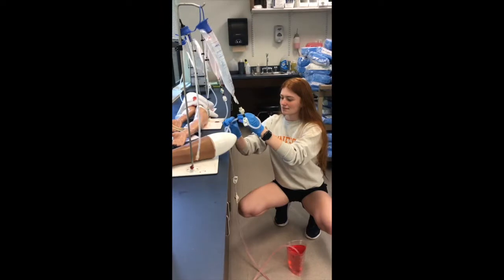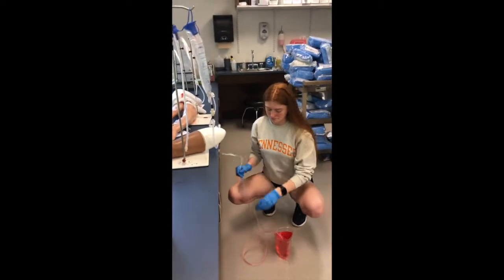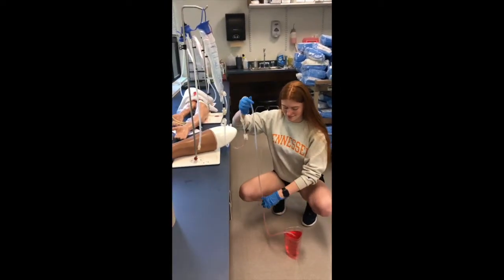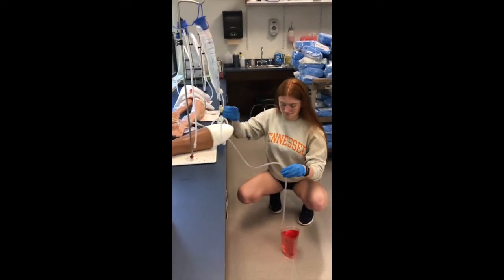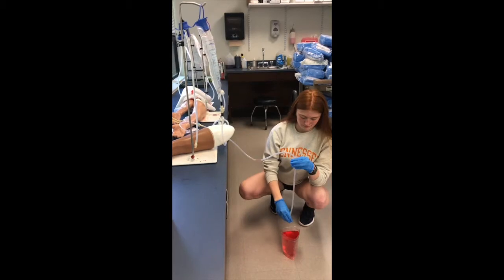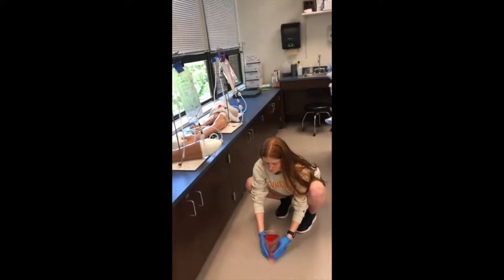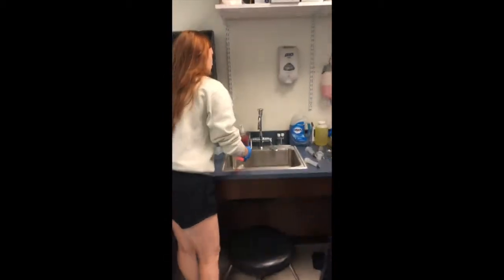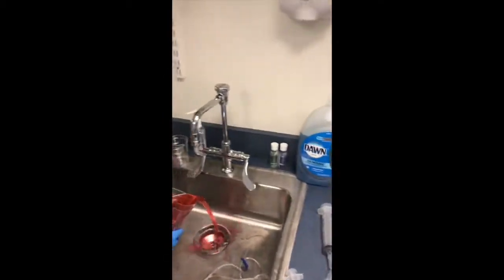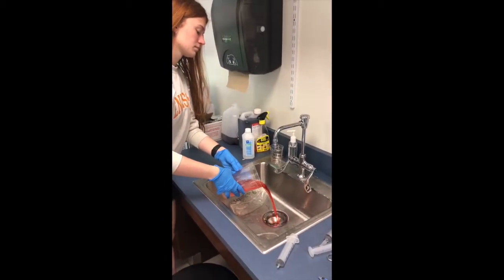After it's drained, come back to it — the canister on the floor should be almost full and all the tubes should look clear of blood as much as possible. First, dump all that water out in the sink. This stuff will stain your clothes, so try to be careful.